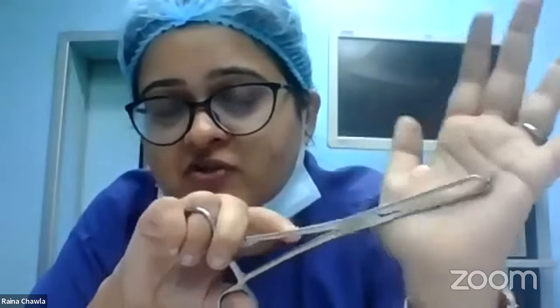Okay, so Khadija is asking, is it possible for you to repeat the names of instruments once again? I will, Khadija. Can you tell me which instruments? The ones for DNC? Just let me know and I'll repeat those. So this is an Allis forceps.